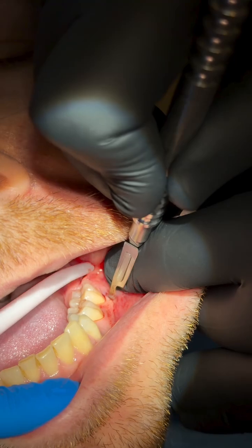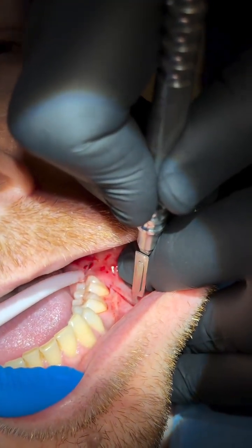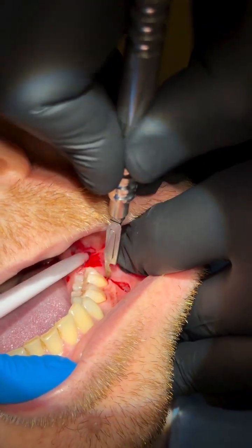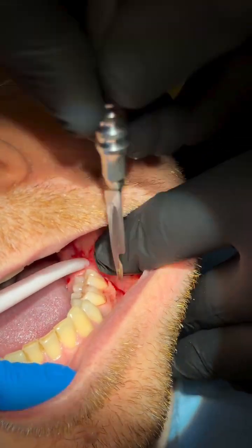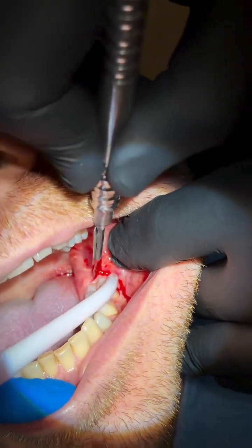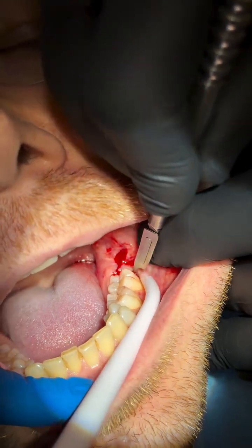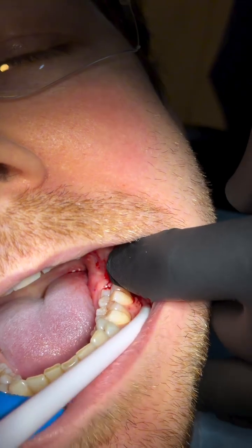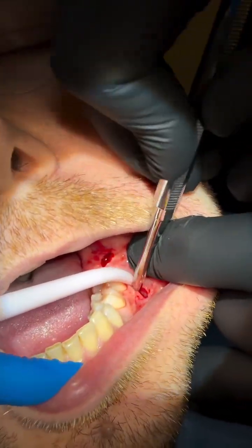Here I am making the incision, a two-sided full thickness mucoperiosteal flap using a 15C blade. As you can see, I'm cutting with the belly of the blade down to bone, with my finger on the external oblique ridge as a landmark, and also stretching the tissue so that cutting can be easy. So this is a two-sided full thickness mucoperiosteal flap.